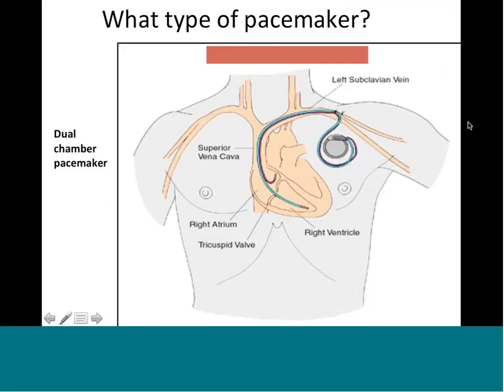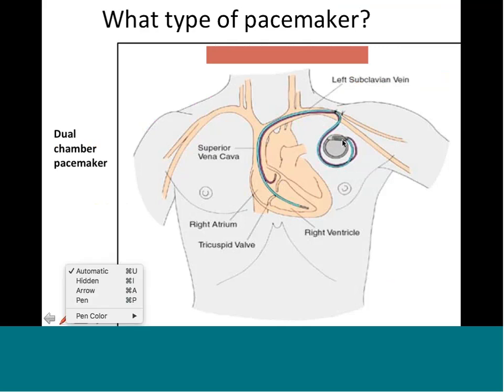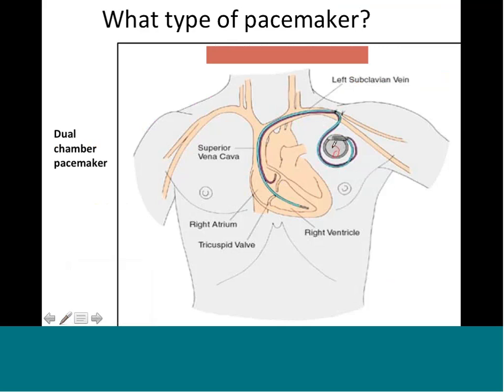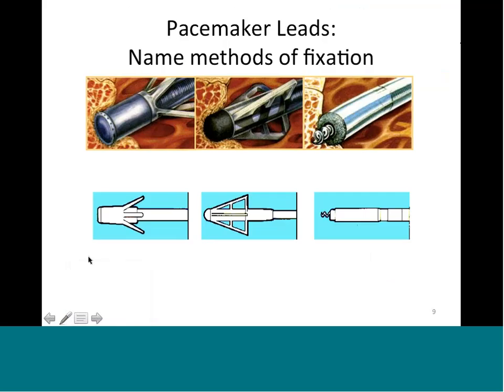What is the type of pacemaker here? If you can see here, this is a dual chamber. Now look at the pulse generator here - this is your pulse generator, this is your electronic circuitry, and these are your leads. You can see one lead is here in the atrium and one lead is here in the ventricle. So this is a dual chamber pacemaker because it's in both chambers.